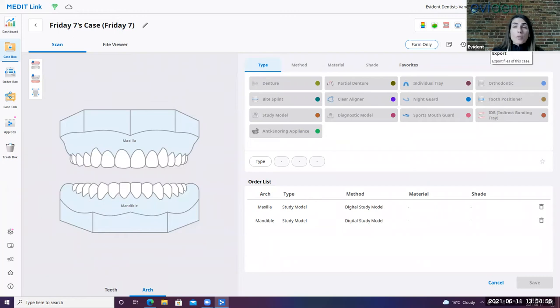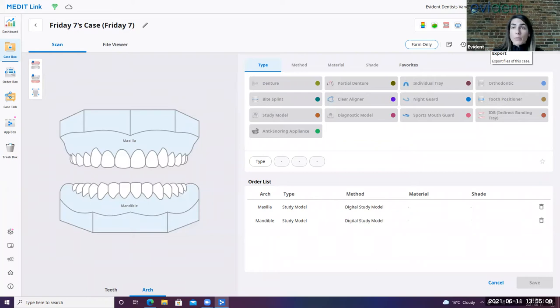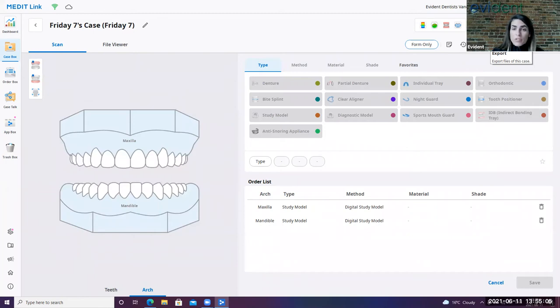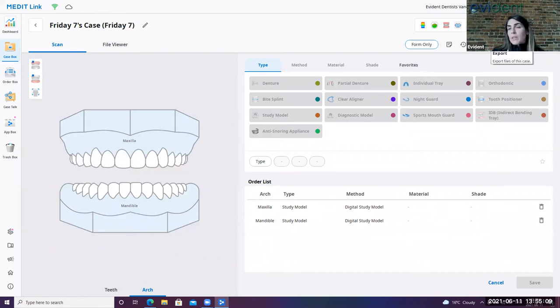You can also export your scan. This can be helpful if you're wanting to take it out of the Medit without going through the Medit link. You have three different ways that you can export it. You can do it as an STL, which is typically what's used at the lab, is a non-color scan, or as a PLY or an OBJ, which are both color exports.